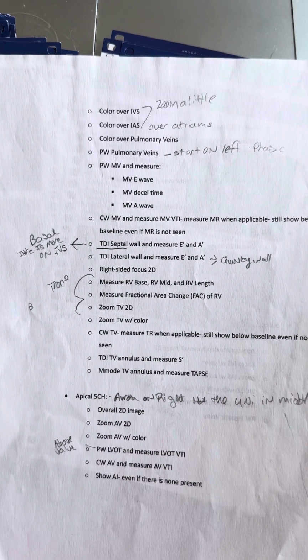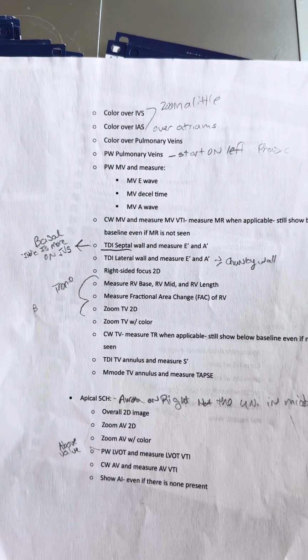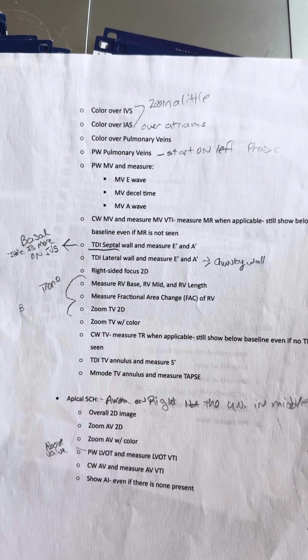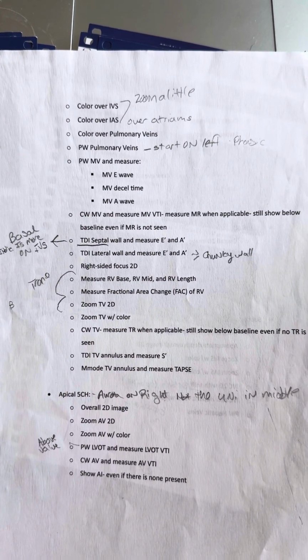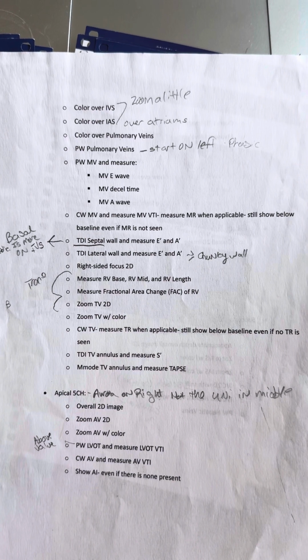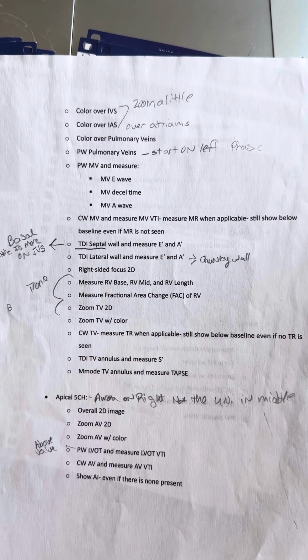You will then zoom into your tricuspid valve and put color over it. You'll then put a continuous wave through it and measure TR. You will bring your baseline up to see underneath it.